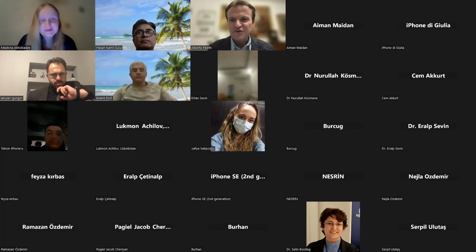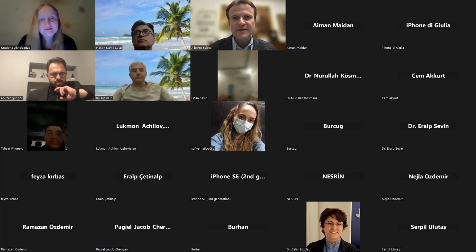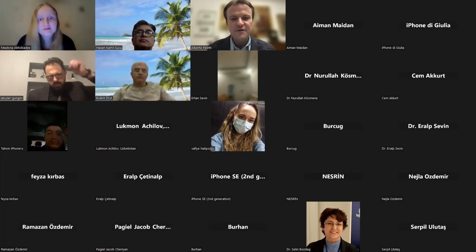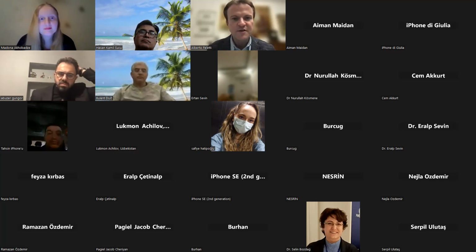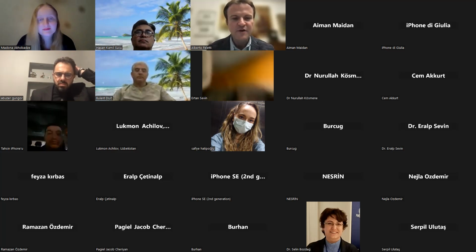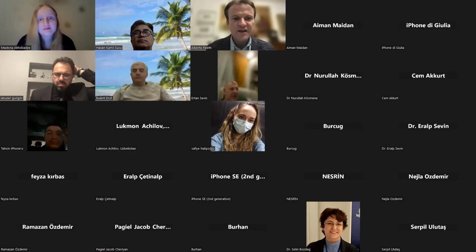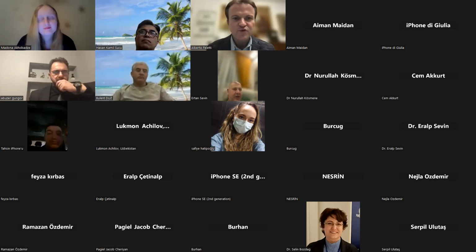Yeah, good question. I think that nowadays a neurosurgeon must master both rigid and flexible endoscopes. So to a certain extent, both instruments have a common learning curve initially, at least for operations in the lateral and the anterior third ventricle. Of course, my advice is to start from the simplest operations. First, shadow an experienced endoscopist to see as many operations as possible. This is what I have done.